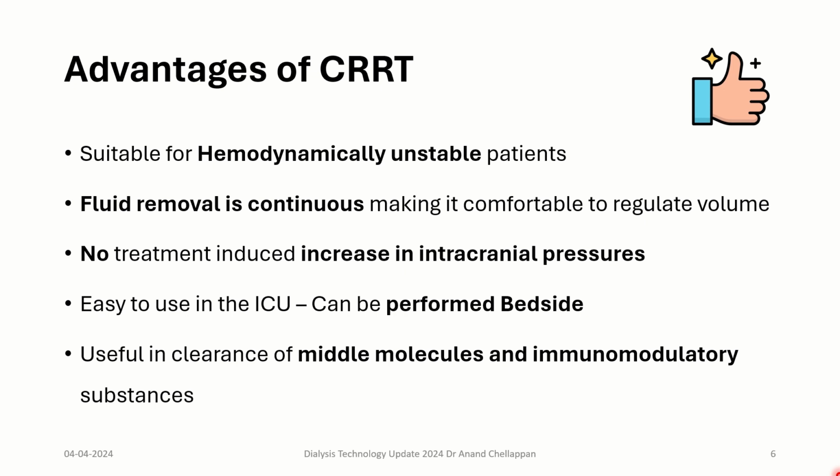Another advantage of CRRT when we compare it with hemodialysis or SLED is there is a better clearance of middle molecules and immunomodulatory substances in addition to small solutes.